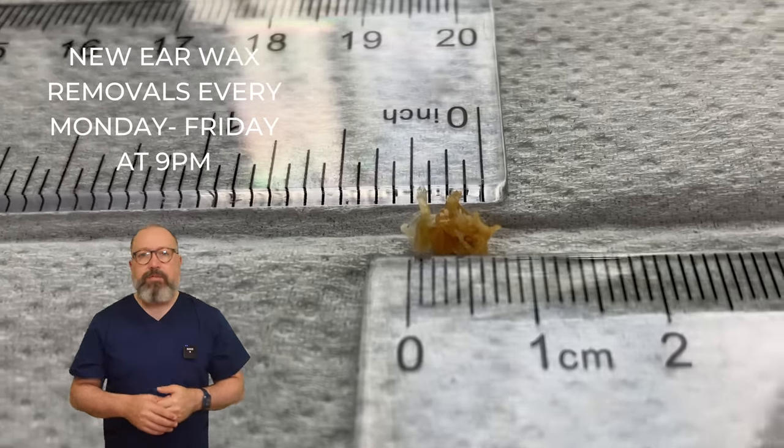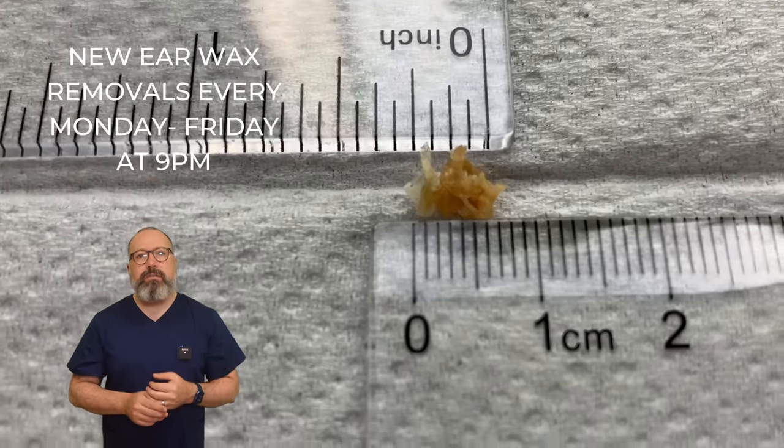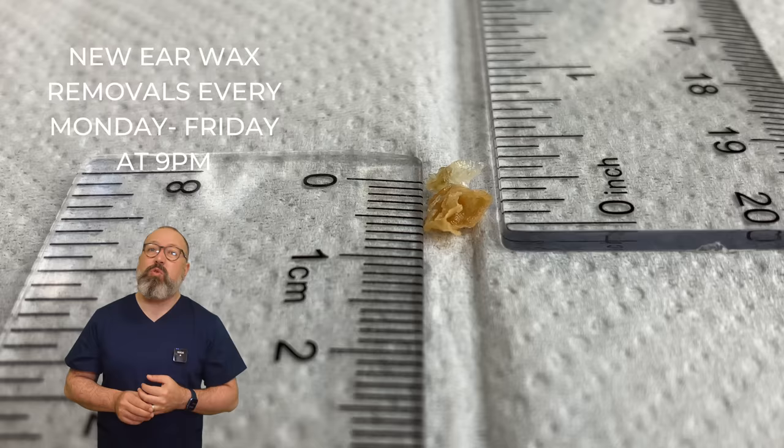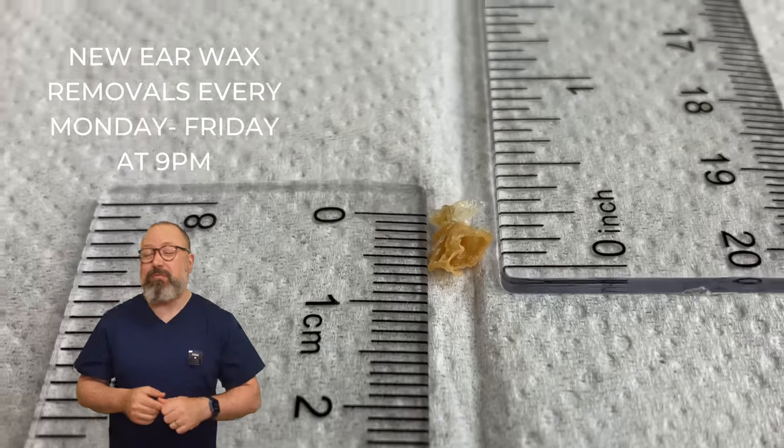But yeah, lovely patient though. You can see just over half a centimetre here — it's probably just bang on a quarter of an inch. I did remember that, though I haven't checked the ruler shot out.